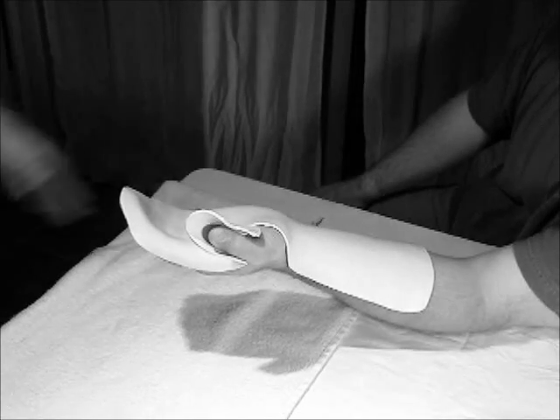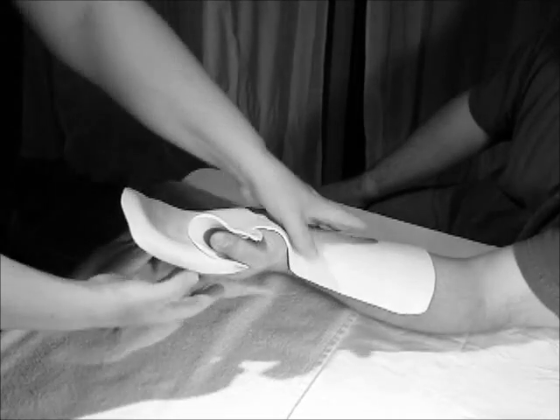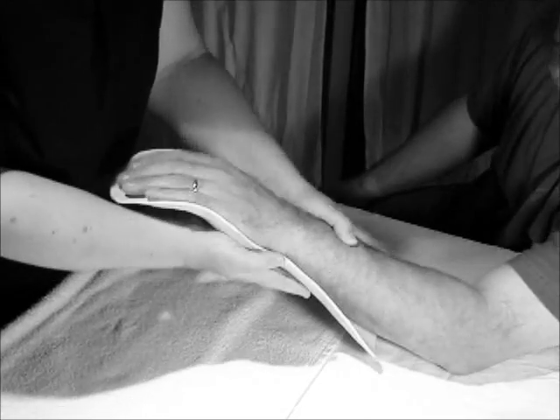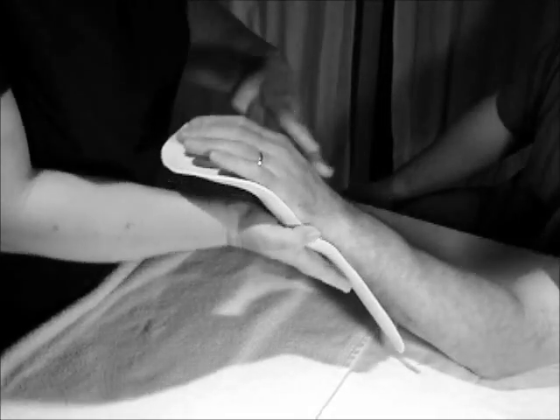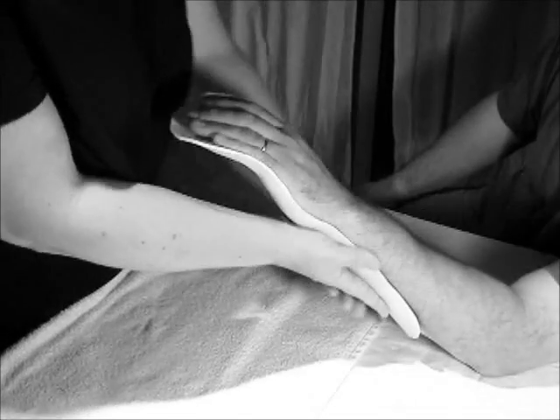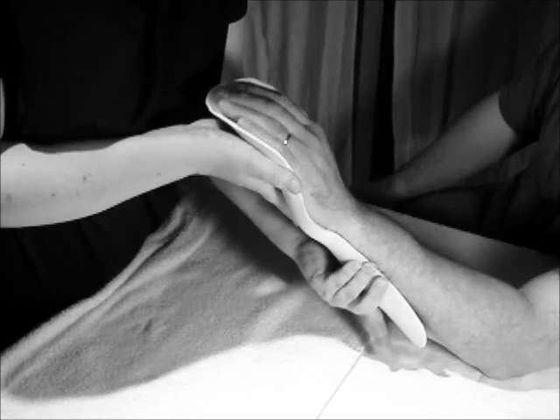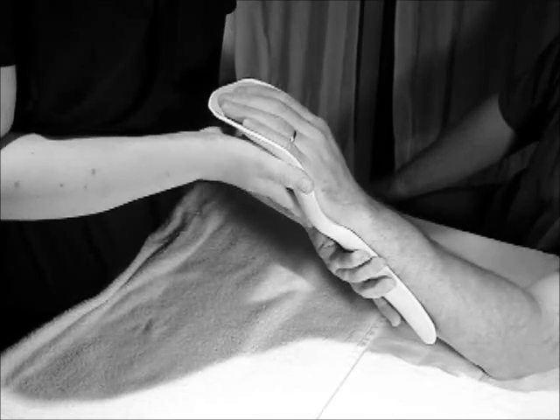So I can feel now that that feels nice and firm, and so what we're going to do is we're going to work together and turn the arm over. And I'm going to make sure he brings his wrist back just a little bit, right? And I'm going to make sure this fits him just like it's supposed to. And you can tell it still needs to sit up for just a second.